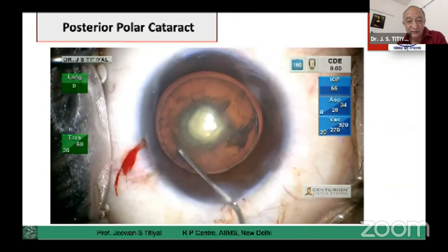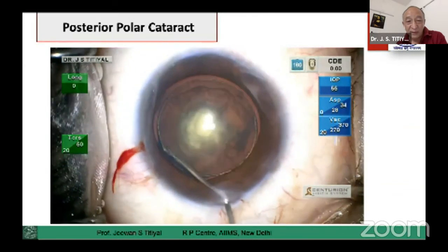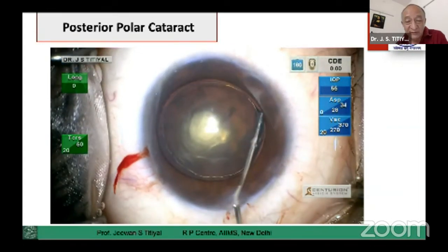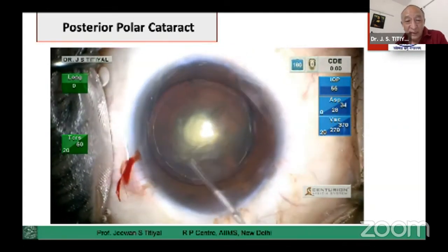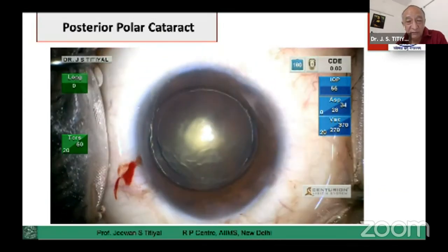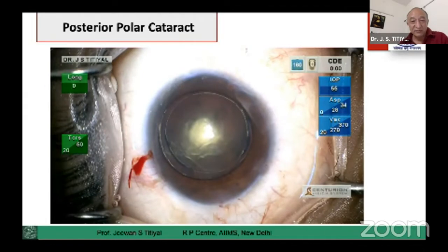Convincingly, we avoid hydrodissection in all these cases. We decrease the pressure, remove viscoelastic. This is one hydrodelineation — you can see here — and we do another hydrodelineation, so we have two rings of hydrodelineation, and that will safeguard us from the posterior capsule. We have a cushion of epicortex which will maintain the integrity of the complex till the end of surgery.